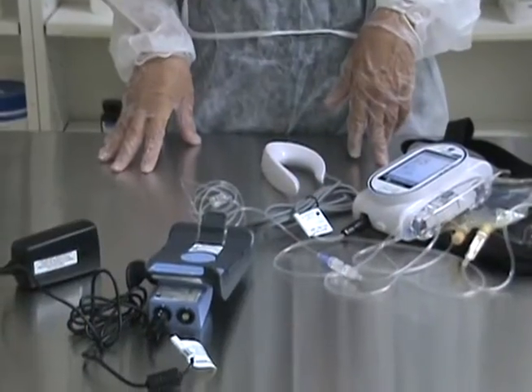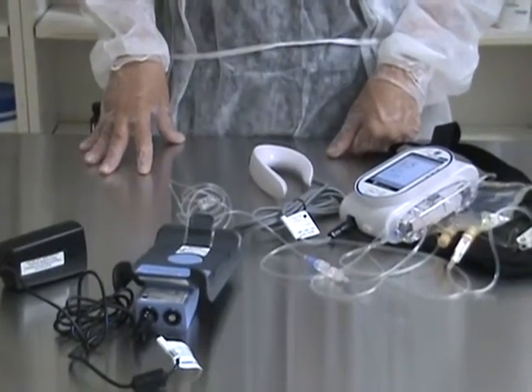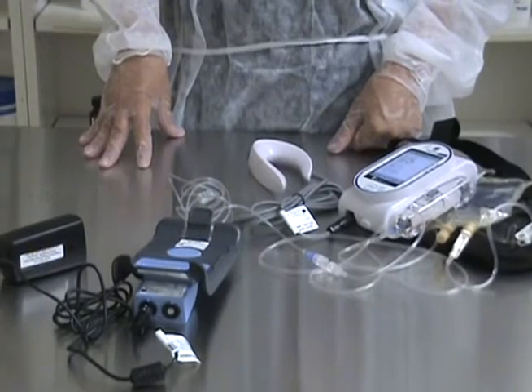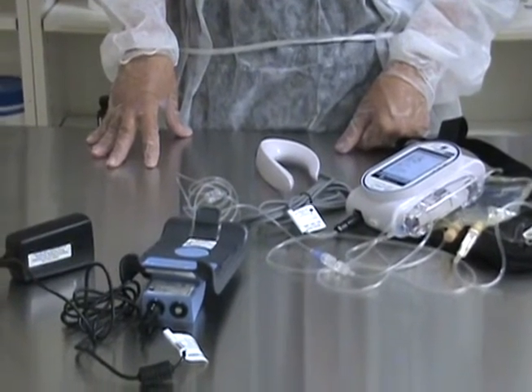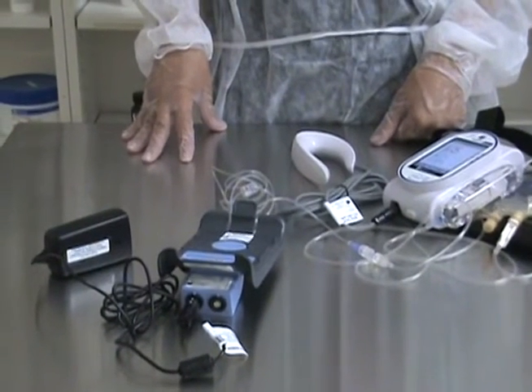I will demonstrate how to charge the battery. Remember that the sapphire infusion pump does not take disposable batteries — they need to be charged. I recommend charging the battery at night while the patient is sleeping so you don't have any interruptions in the pain management.